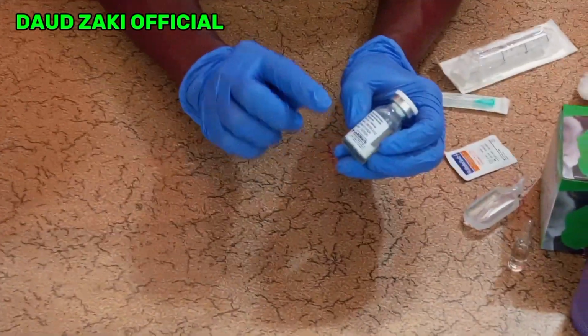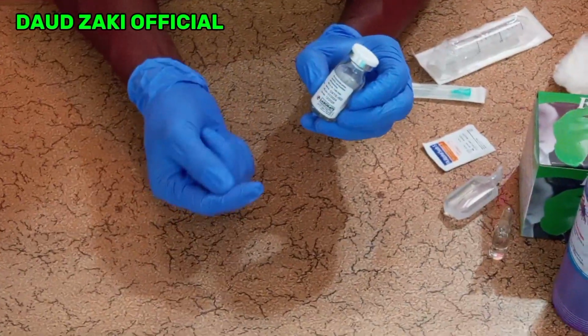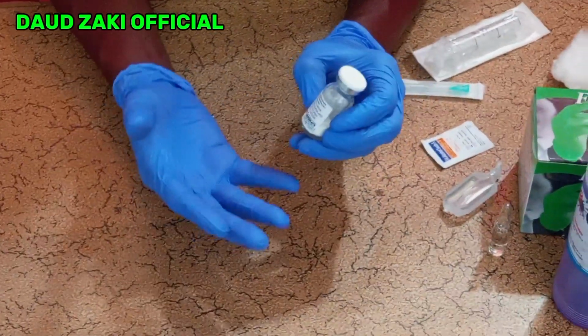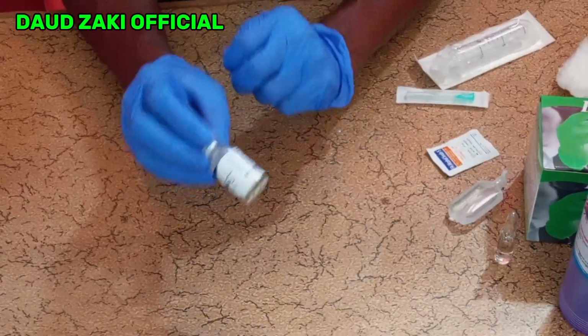You must also look at the expiry date of the drug. So you have to check the expiry date, the name of the drug, the direction for use, the method you are going to reconstitute, and the amount of diluent you are supposed to withdraw so that you can reconstitute the vial. You have to check that first.